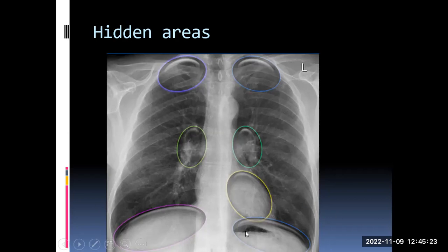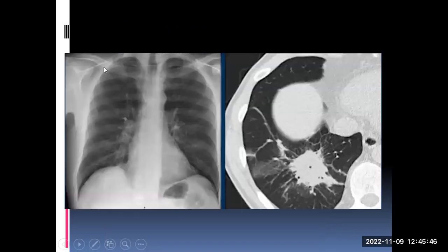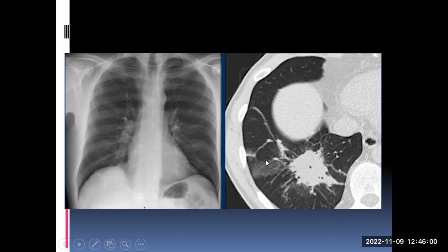You also have to look at the places outside the chest wall, especially the sub-diaphragmatic region. The diaphragm is a dome-shaped structure, so when you look at this area there is some lung tissue coming anteriorly and posteriorly below the level of the dome. Looking at an X-ray example, there is a subtle density below the diaphragm which caused the radiologist to proceed to cross-sectional imaging, where a malignant mass was identified. These hidden areas play a very big role in the interpretation of chest X-rays.